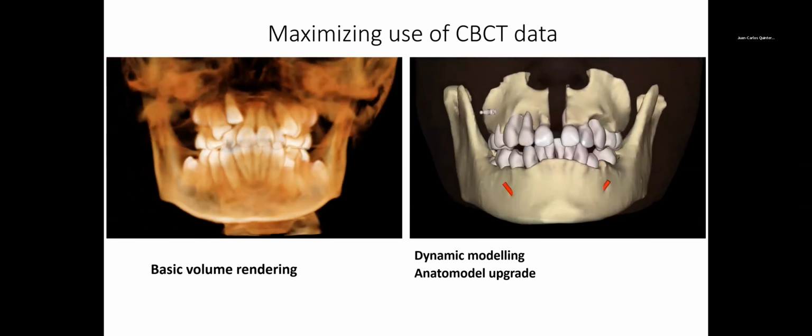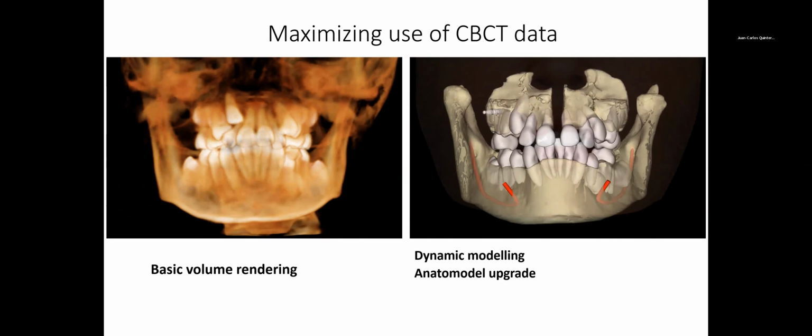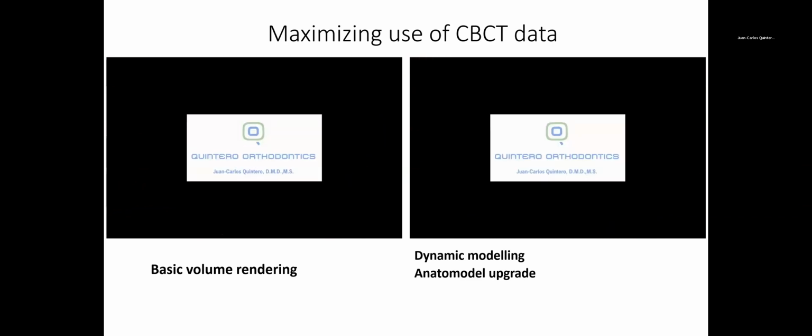The patient can see the treatment plan. They can see the confidence in the doctor. They say, okay, I understand now, right? So these things are not designed for the same day start office.